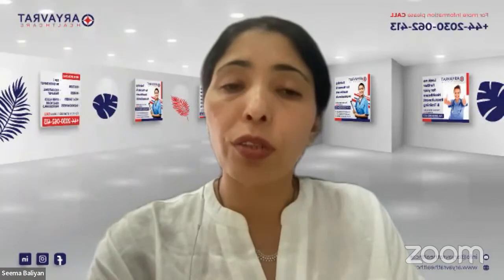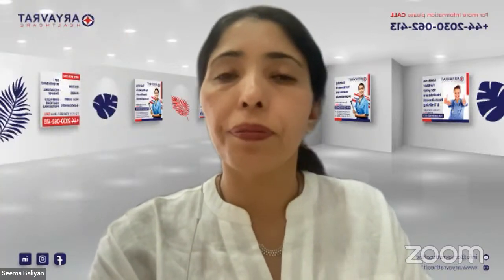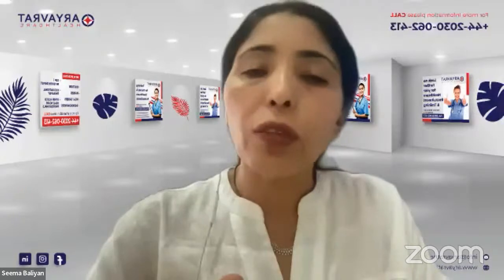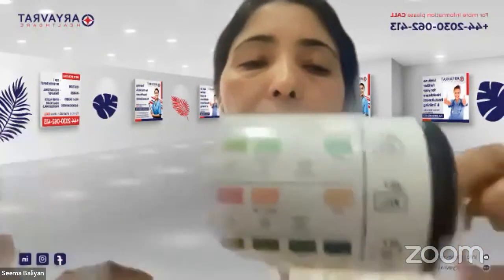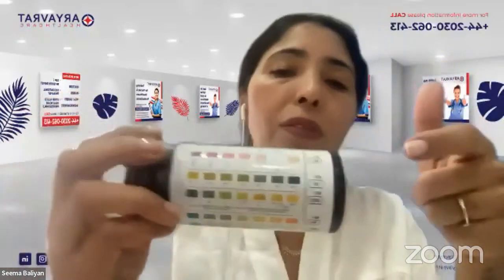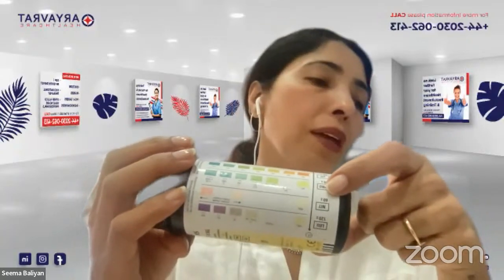Now, have all of you understood this? It's slightly tricky, but have you understood the principles of how we are going to be checking it? Yes. So you do not need to mug up the timings, because the timings will already be indicated on the bottle. So over here, it is going to say at what time you have to read what reading.